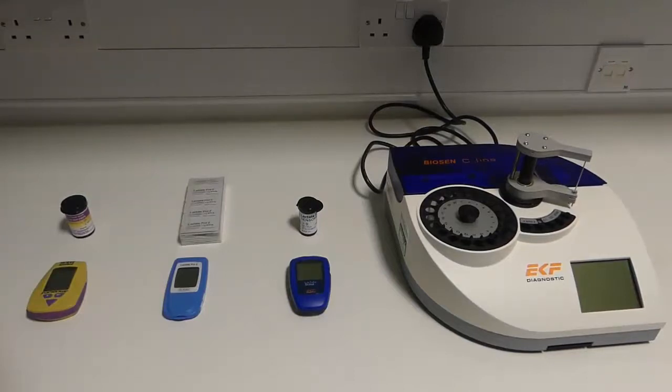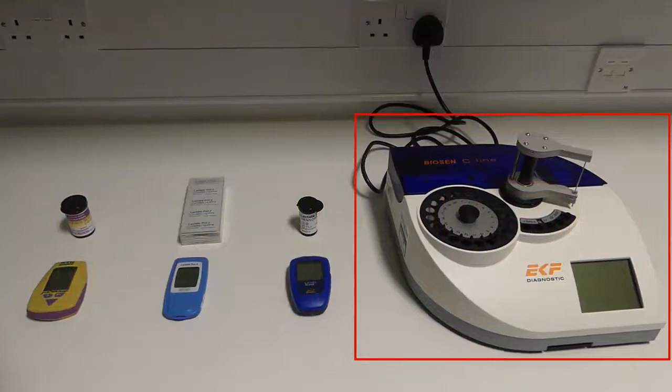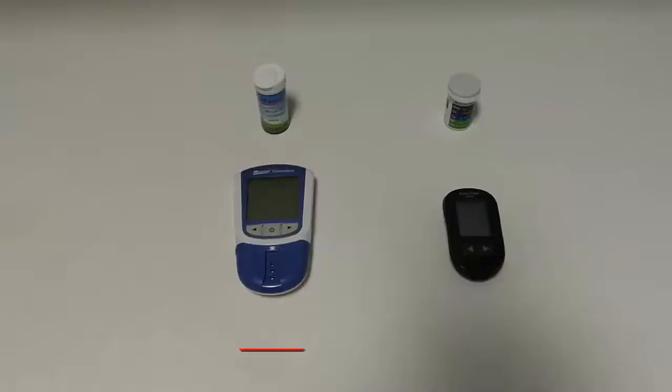This includes lactate testing, in which we have a variety of portable handheld lactate analyzers and one lab-based analyzer. Finger prick blood sampling is also used for cholesterol and glucose testing.